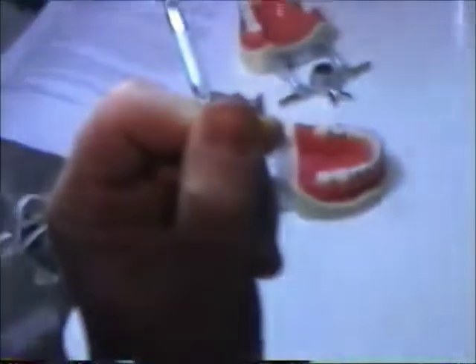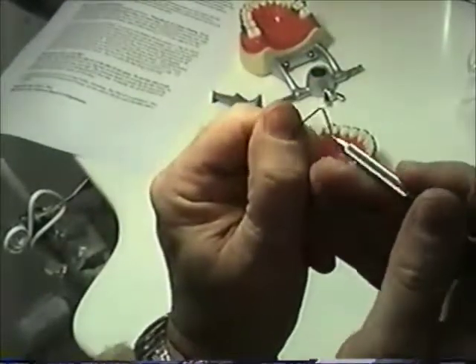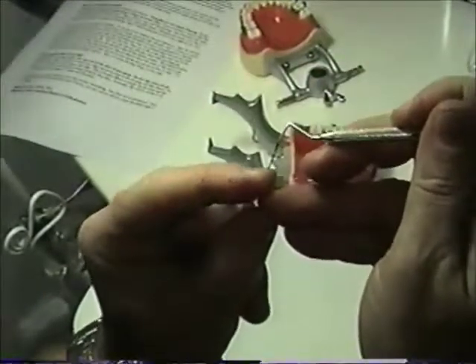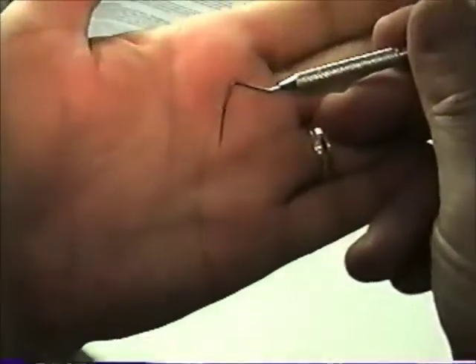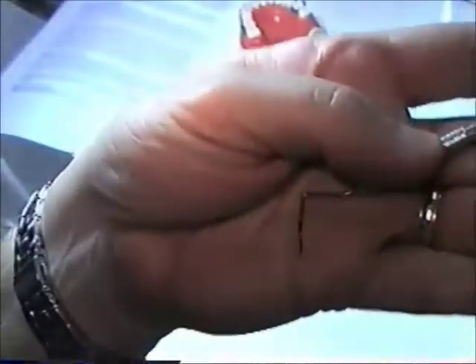If you notice with this probe, let me see if I can get this in focus. There you go. It's in focus now. But notice this probe has different readings on it. And each one of these readings is a different amount of millimeters.